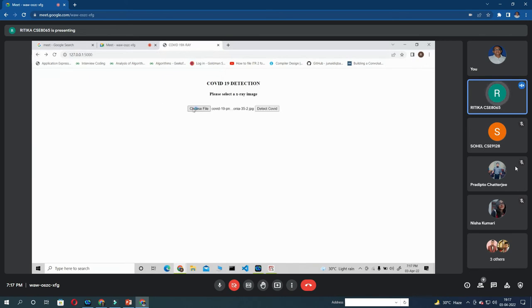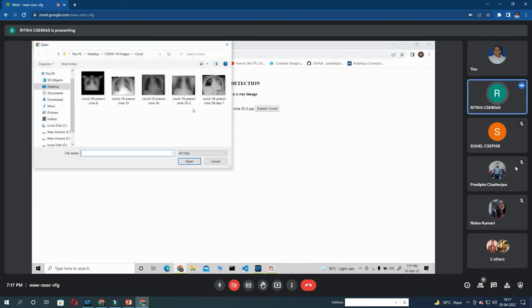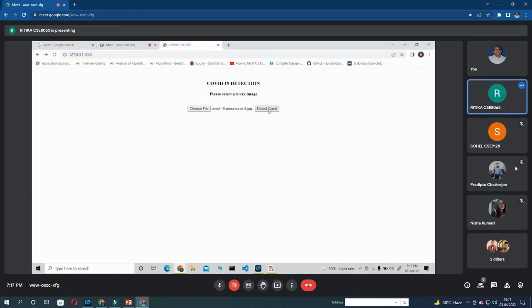Similarly I will choose another file. Say the first one. Detect COVID. COVID positive.